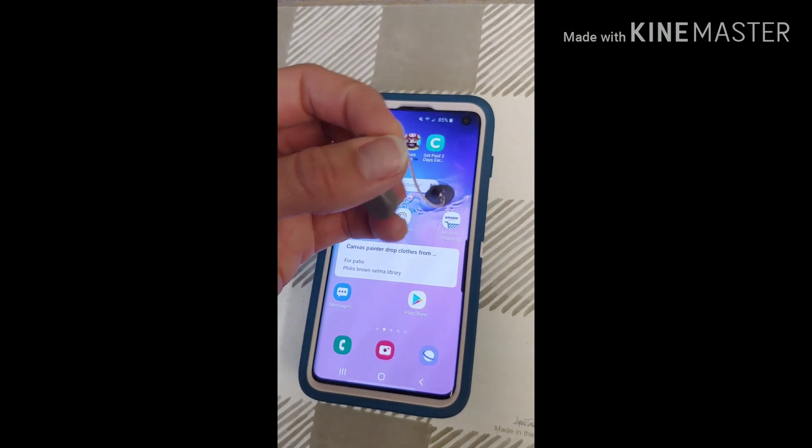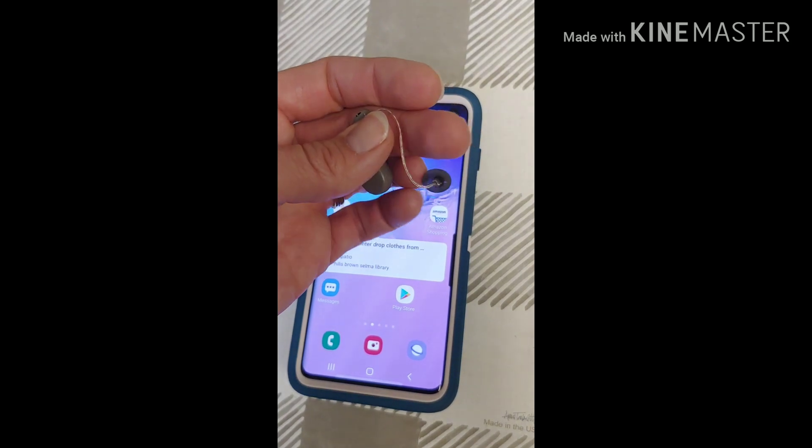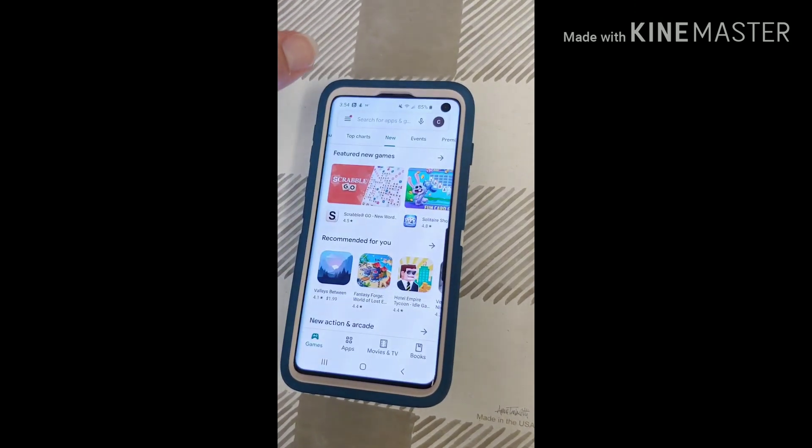On the Android phone, you're going to go to the Google Play Store. But on the Apple products, you're going to go to the App Store. So we're going to click on the Play Store here.